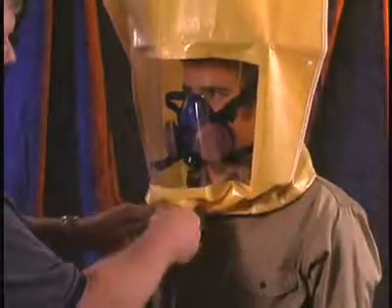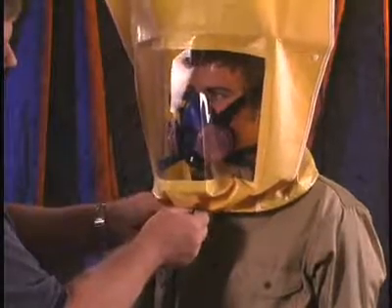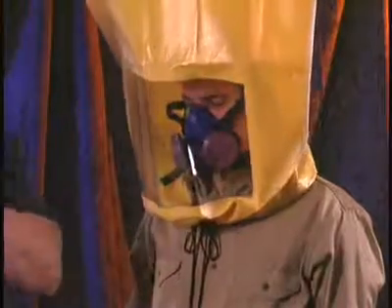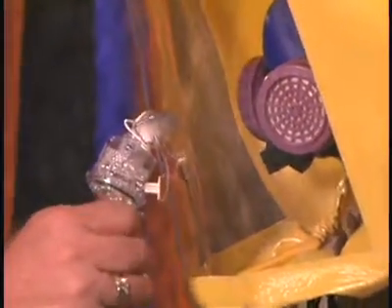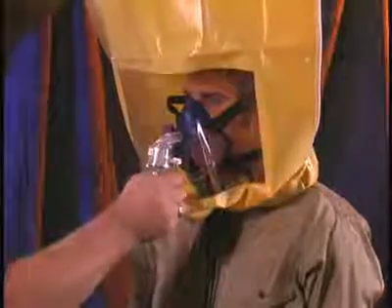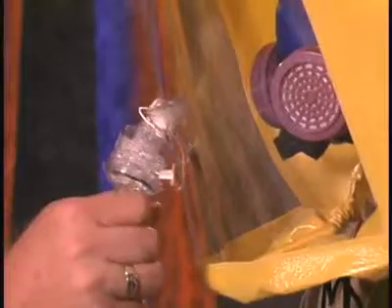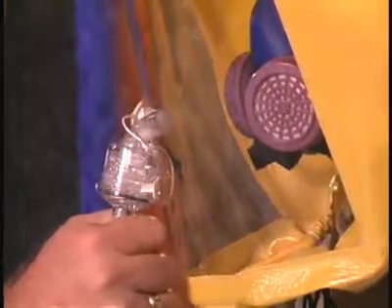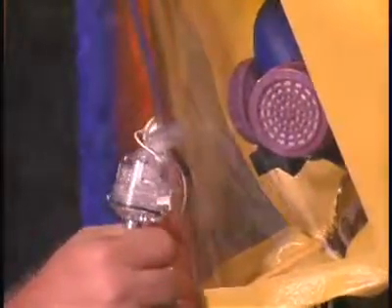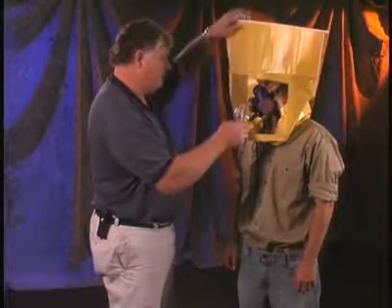Have the subject don and position the hood, ensuring that there's room for dispersal of the aerosol and for movement of the subject's head. Remind the subject to breathe through their mouth. Inject the aerosol into the hood with the same number of complete squeezes as in the sensitivity test, that is 10, 20, or 30 times. To maintain an adequate level of the aerosol during the test, inject 1/2 the number of squeezes every 30 seconds. Tell the subject to indicate if they detect the bitter taste of Bitrex at any time during the test.